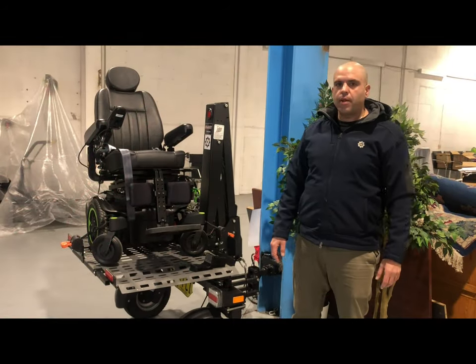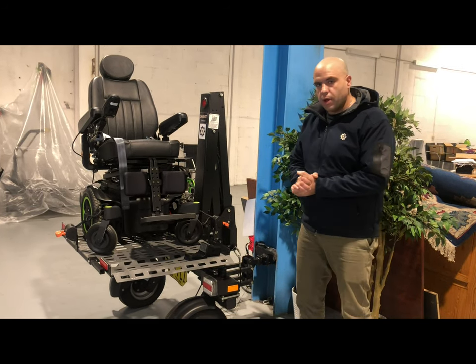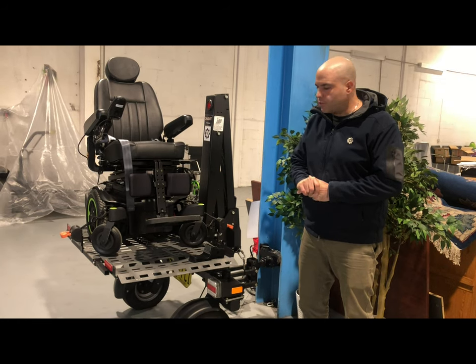Hi everybody, thanks for tuning in. Ali F. Mariam here from Mobility Engineering. Today we're here to talk to you about this wonderful product, the Bruno Independent Living Aid's Chariot Trailer device.